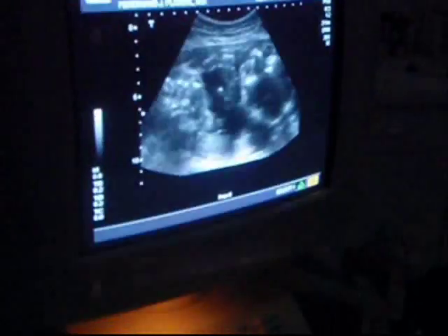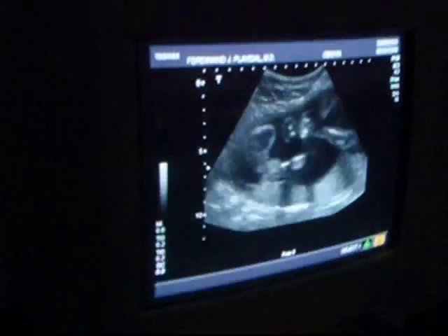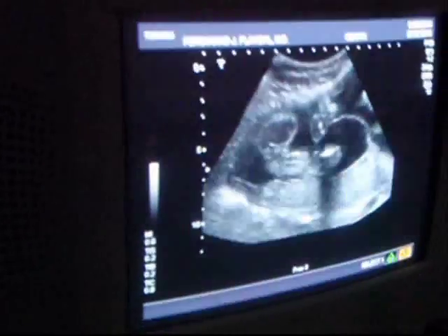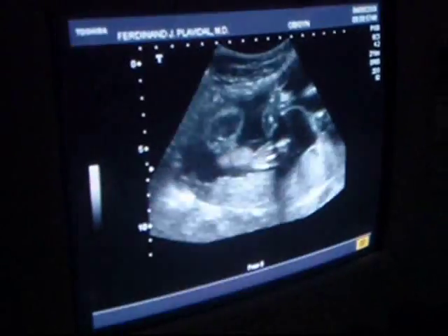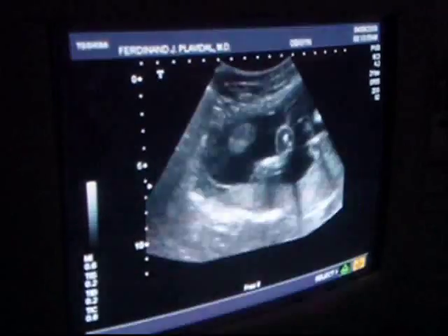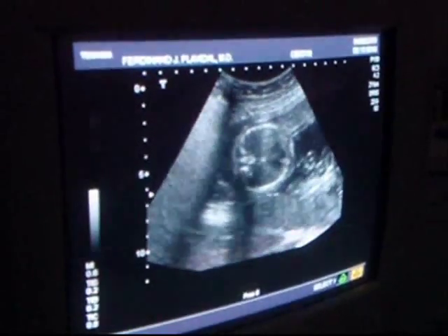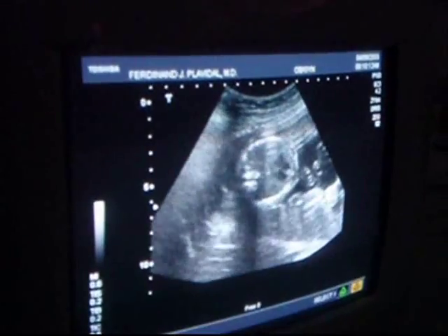So I really just relate to what I see so well. Okay, now there's a rear end over here on the left side, and did we talk about gender on these kids? Yeah, we have. Yeah, this is obviously a girl sitting over here. There's girl parts there. These are the labial folds sitting right there. This is the baby on the left. That's a butt. There's an abdomen. Here's the heart. Nice chambers of the heart there, particularly the ventricles right there.